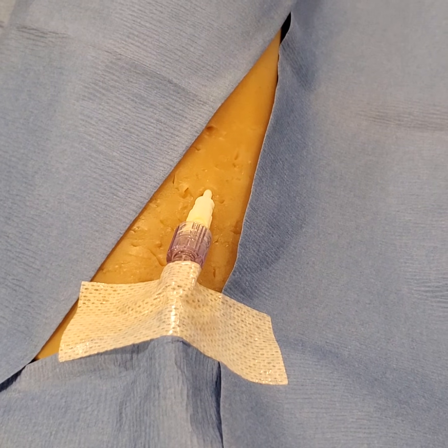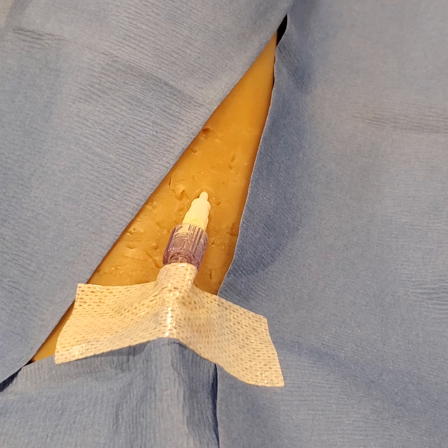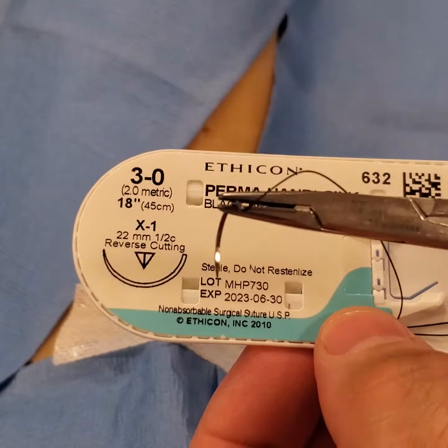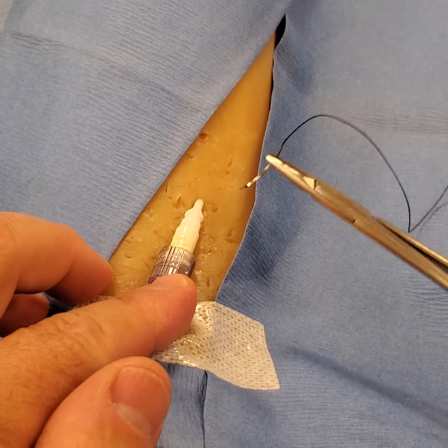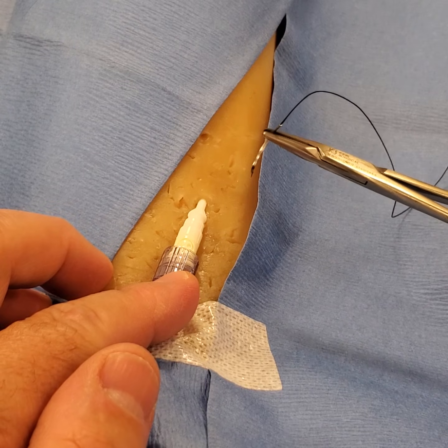This video talks about suturing a standard indwelling catheter without flanges. We're going to be using 3-0 silk and straight needle drivers. Because there's no flanges, there's nothing to really secure it to, so what we need to do is create an anchor point on one side.